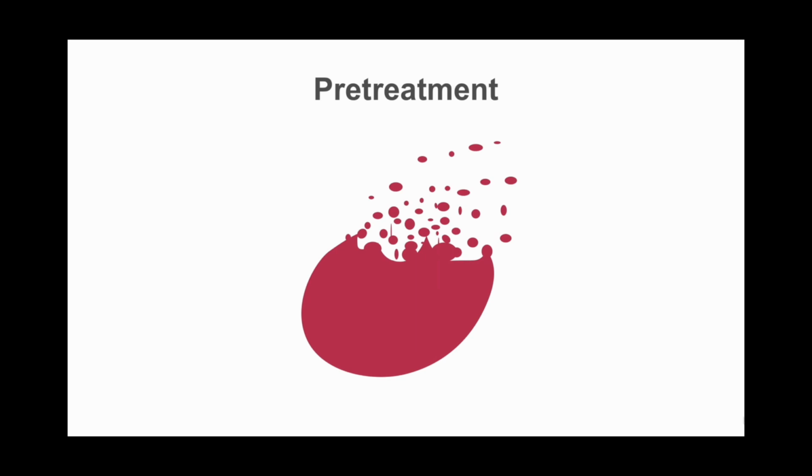The side effect of chloramine is that whenever the municipality has gone for chloramine treatment instead of chlorine, and the carbon filter gradually wears off because of subsequent use, there are chances that chloramine may go into the patient's tissues, into the patient's system, and that can cause hemolytic anemia.